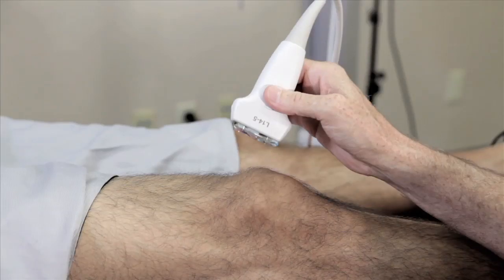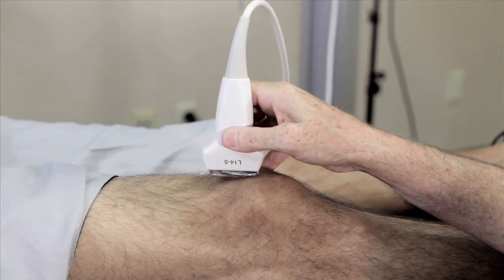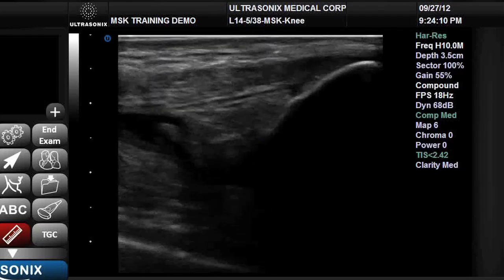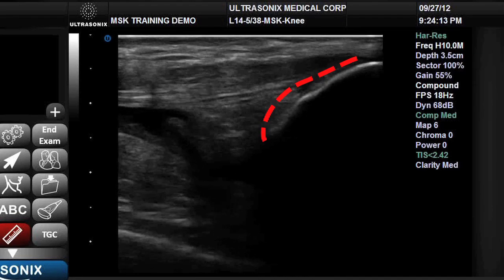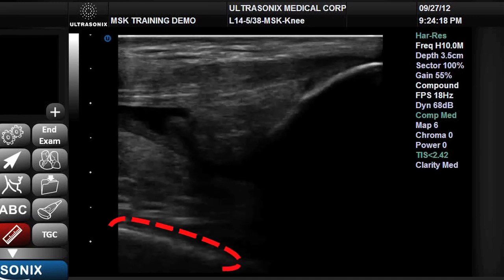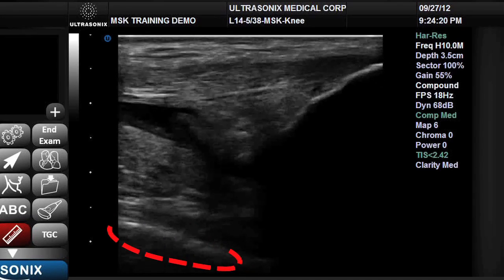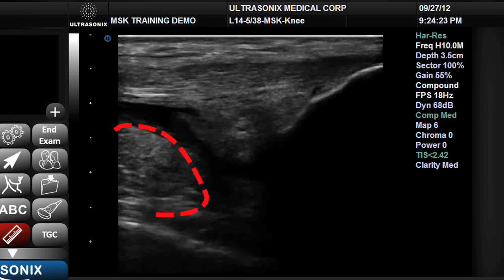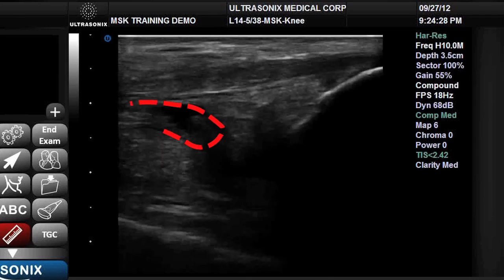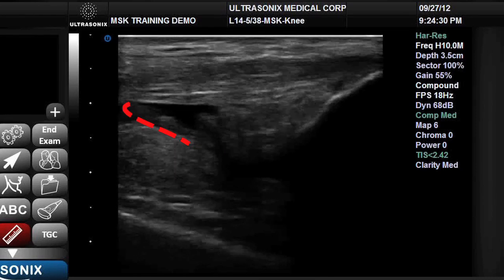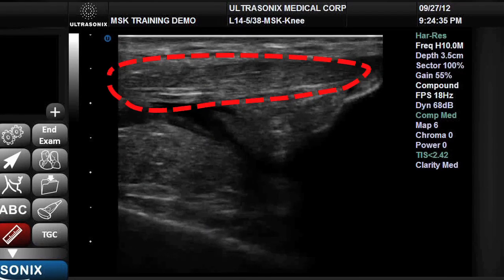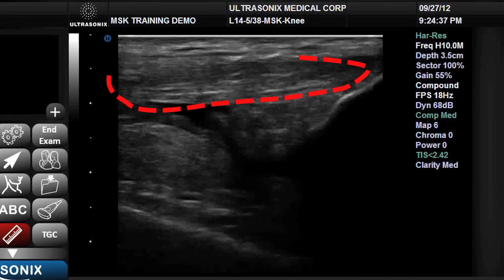With the patient properly positioned in slight flexion in the knee, we place the probe in a longitudinal orientation. The ideal image should visualize two bony landmarks: the cortical margin of the patella, and deeper to the left the bright hyperechoic margin of the femoral cortex. In between those two margins we visualize the pre-femoral fat pad, the anechoic irregular shape of the suprapatellar bursa with normal physiologic fluid, and superficial to that, the fibers of the quadriceps tendon as they travel down to attach onto the patella.